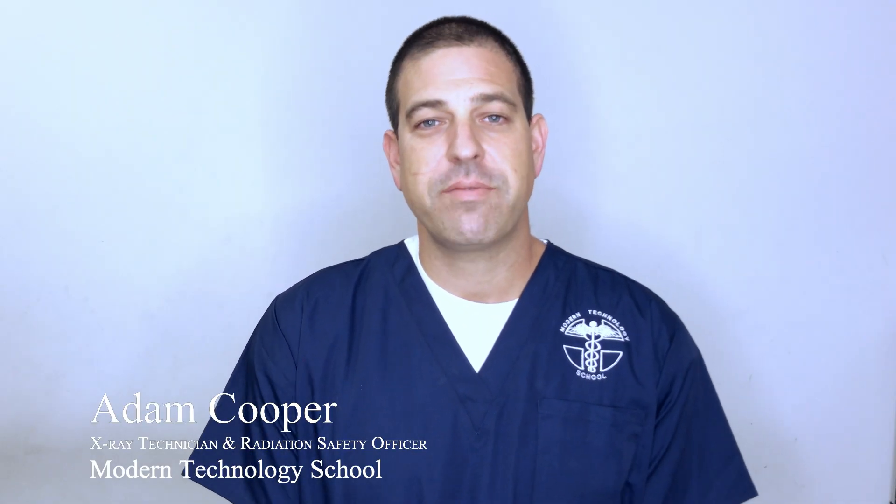Hi, my name is Adam Cooper. I'm a radiation safety officer and an x-ray technician here at Modern Technology School. Today we're going to do a routine elbow series. We use a routine elbow series normally for blunt traumas and elbow dislocations.